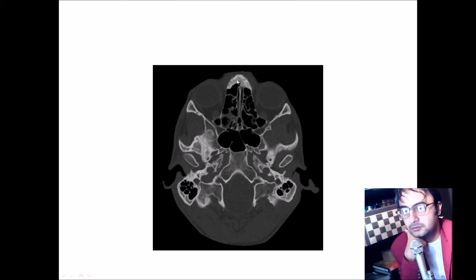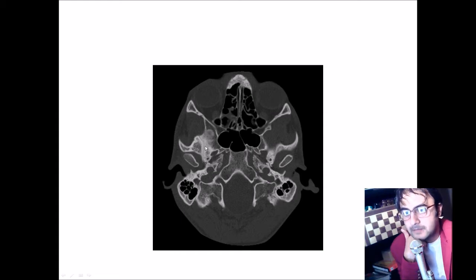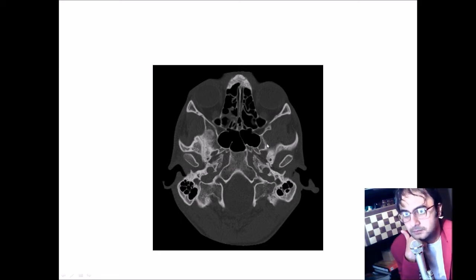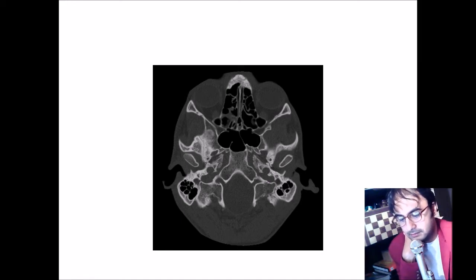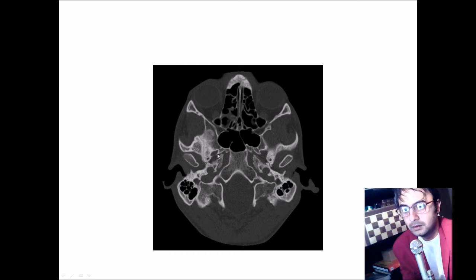Starting from the anterior-most part: this is the nasal bone and the nasal septum. The crista galli is replaced by the nasal septum in this slide. On the lateral aspects are the sphenoidal sinuses, the petrous temporal bone, the clivus, and the condyles. This is the mastoid. This is the foramen magnum and the clivus. A very important structure in this slide: this hypodense canal extending out from the foramen magnum is the hypoglossal canal. Here again is the foramen lacerum, the foramen ovale, and the foramen spinosum.